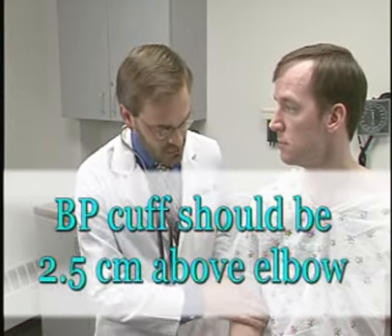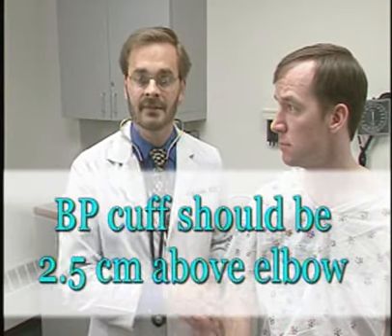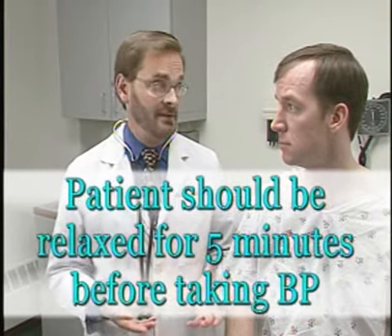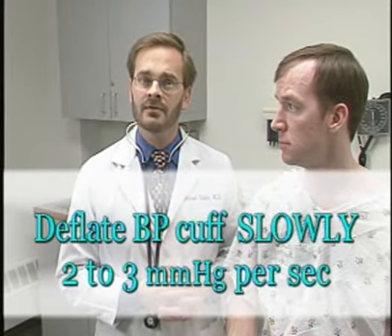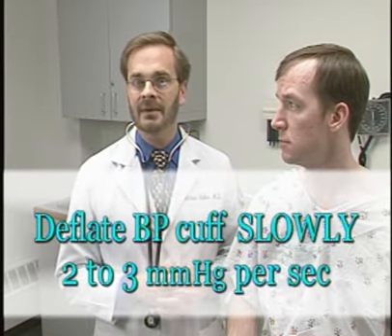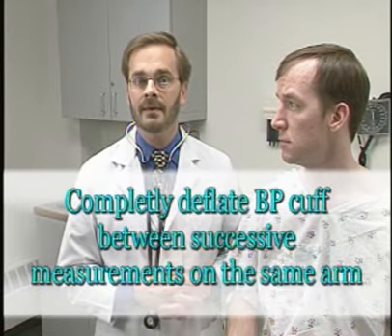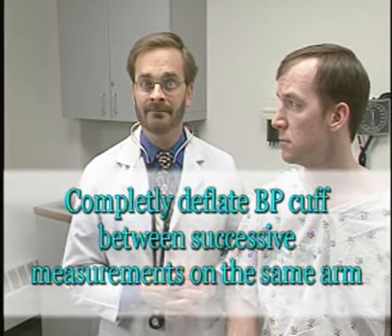And also, if the cuff is too low on the arm, you'll occlude the brachial artery and it will be difficult to hear it. Next, if the patient's not relaxed, if they're upset or crying. And then if you deflate the air from the blood pressure cuff too quickly, the air will move down so fast you won't be adequately able to tell where the diastolic and systolic blood pressure actually are.